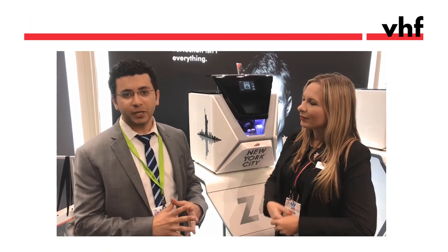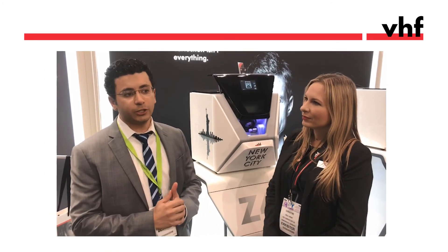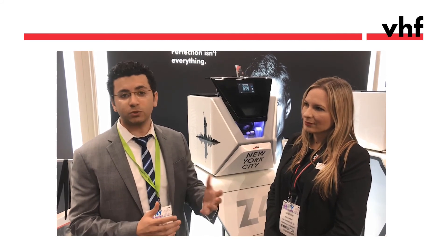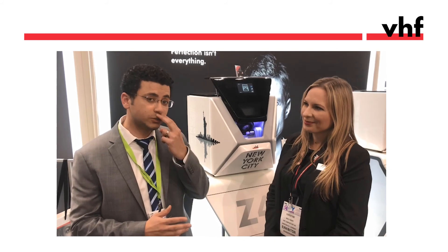I got the Z4 because I wanted something faster to do same-day dentistry, and I was very impressed with the speed. I was actually more impressed when I was able to mill same-day veneers in about 15 minutes for two centrals. Each is 15 minutes, and I was able to deliver the case in less than two and a half hours.